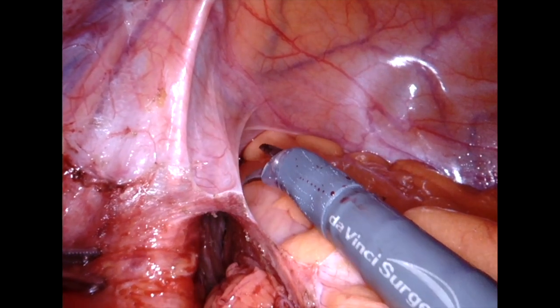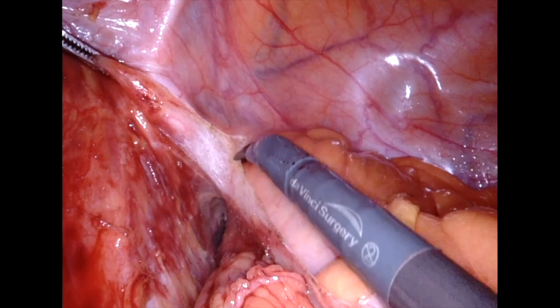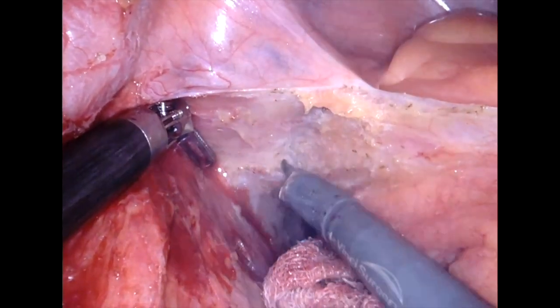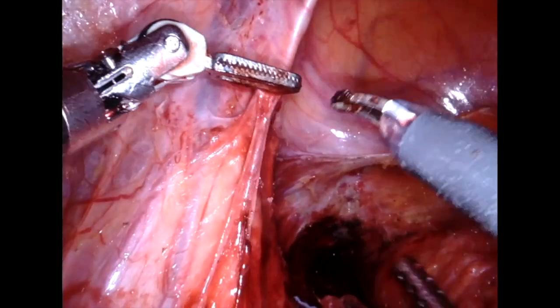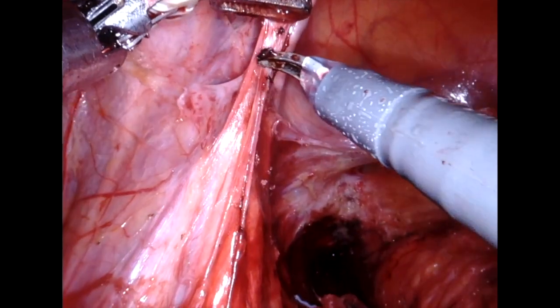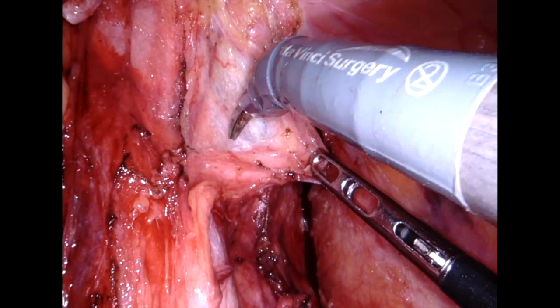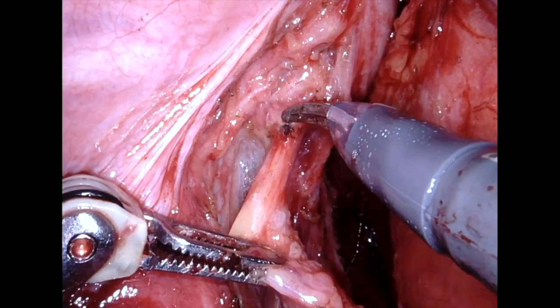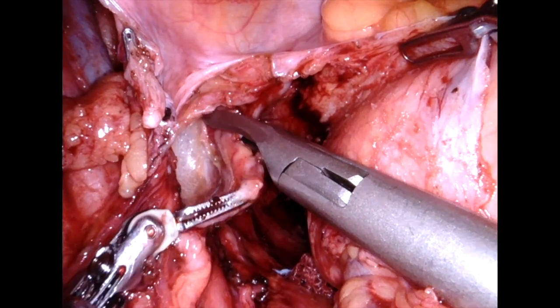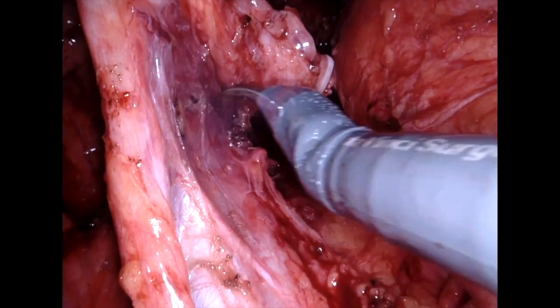We then mobilize the rectum in the pelvis, first scoring the peritoneum on the left lateral aspect. Once the rectum has been dissected away from the lateral pelvic wall, we extend the peritoneal cut onto the left side, just as we did on the right side, and clip and divide the vas deferens. We then dissect along the length of the left ureter, defining the ureterohypogastric fascia. The ureter is dissected along its length, clipped and divided at its distal end, and mobilized for the purpose of future urinary reconstruction.